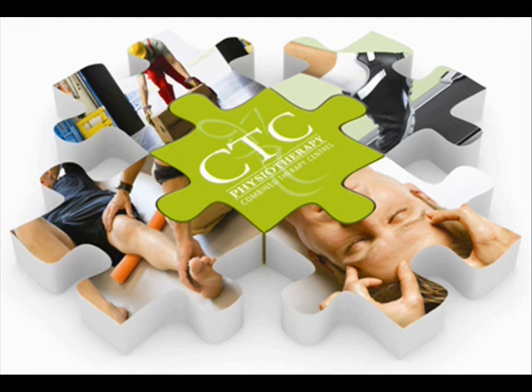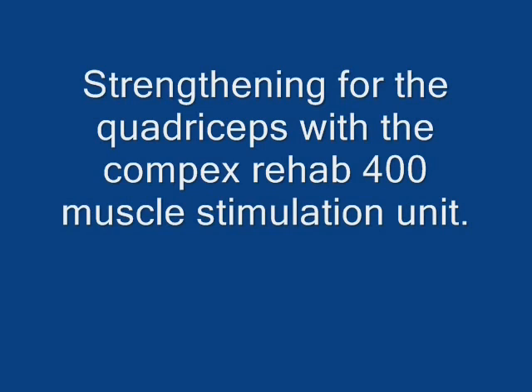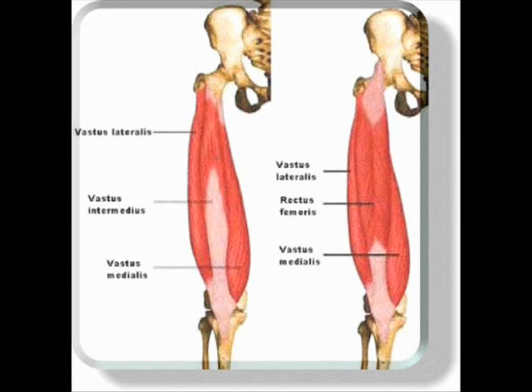Strengthening for the quadriceps with the Compex Rehab 400 Muscle Stimulation Unit. This video is a guide for patients that have loaned out the Compex unit for the week. In this particular video we will show you how to set up the unit for use on the quadriceps, which is the muscles in the front of the thigh. We are going to set the unit up for the strengthening effect.